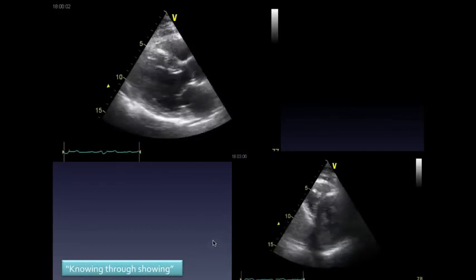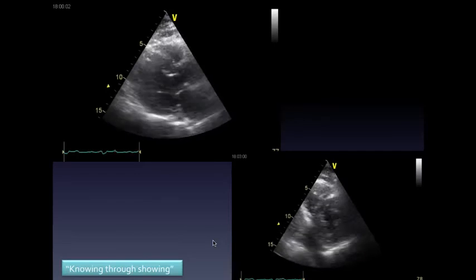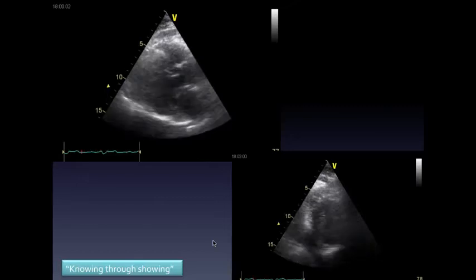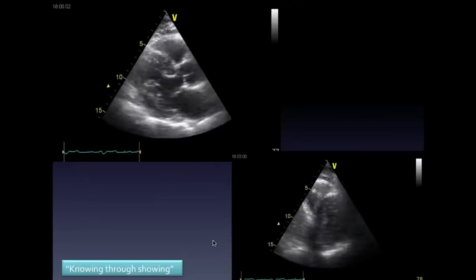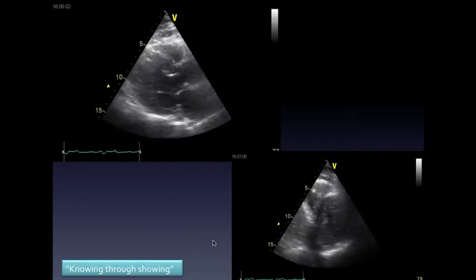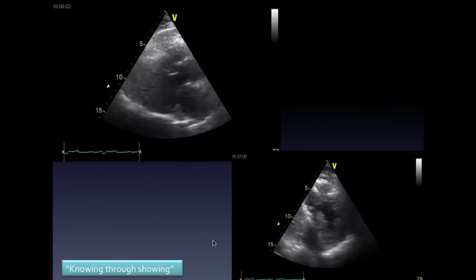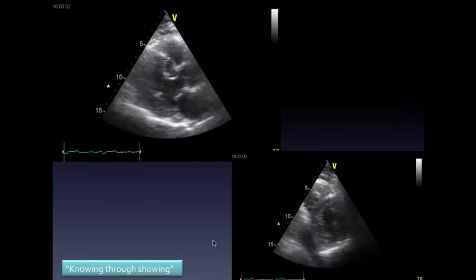I'm purposely showing you these because this is the real world. This is the real patient, and these are the views we get. They're not the beautiful ones I just showed you. So now you'd be a little more confident, I think, wouldn't you? What's your tissue? Isn't it? Yeah, nice job. But at 78, you can have a good prosthetic valve, better profile, lower gradients, avoid the anticoagulants and so on.